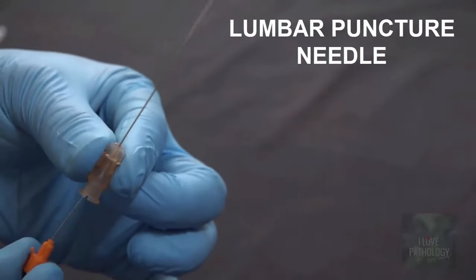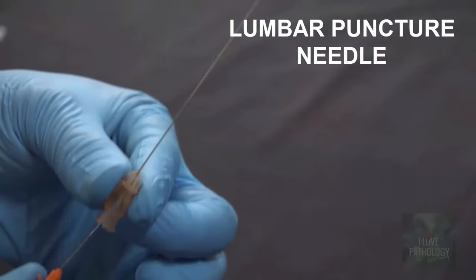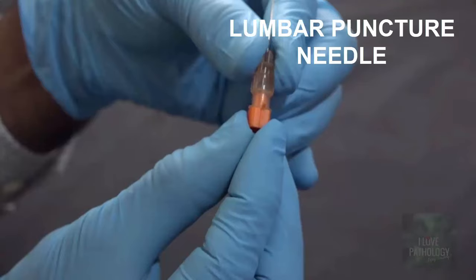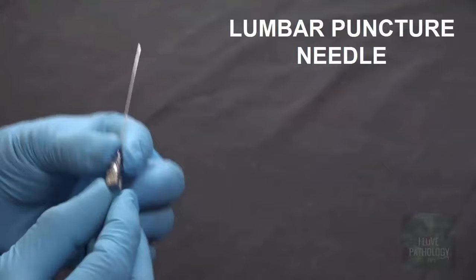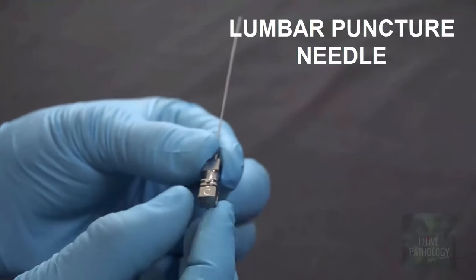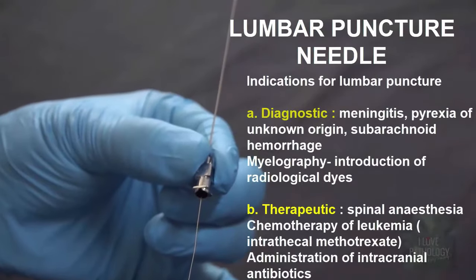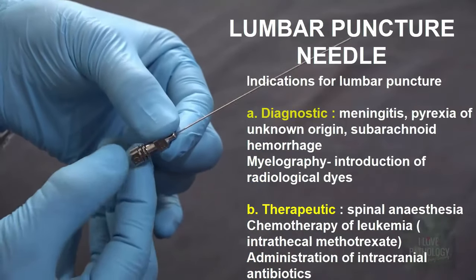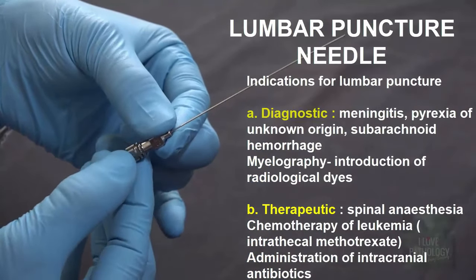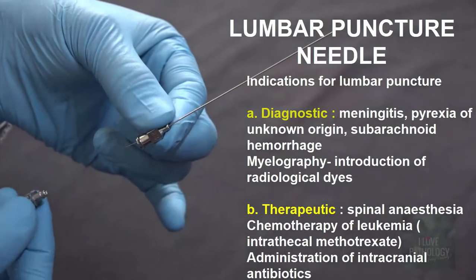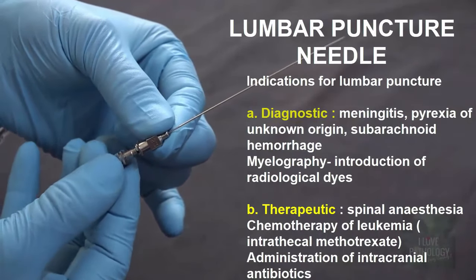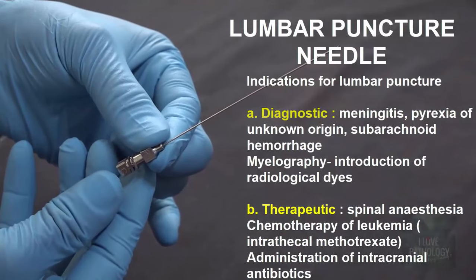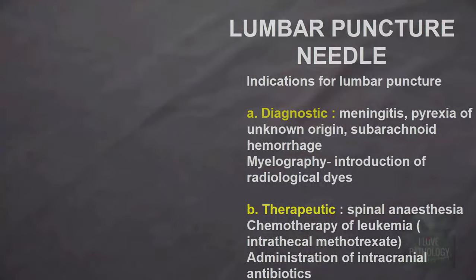This is a disposable LP needle, or lumbar puncture needle. It has a needle with a stylet inside. This is a stainless steel lumbar puncture needle which can be reused. Indications of lumbar puncture: diagnostic indication for analysis of CSF during myelography, and therapeutic indications such as during spinal anesthesia and treatment by chemotherapy or antibiotics.